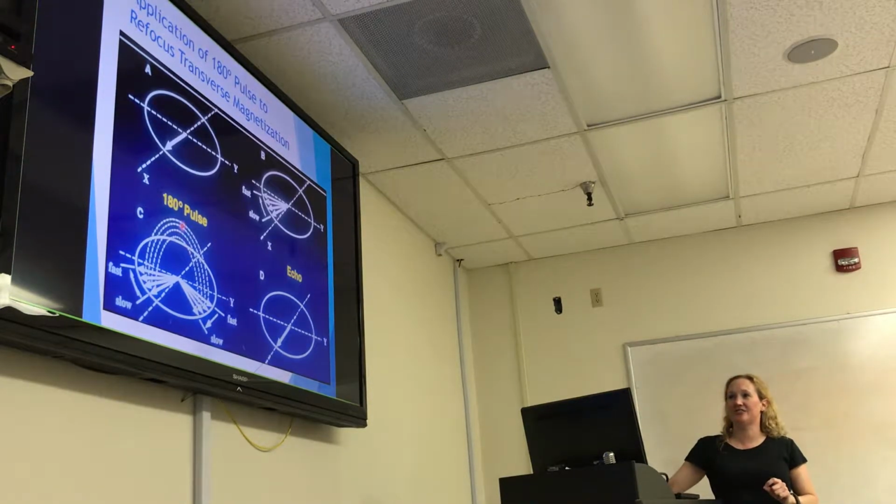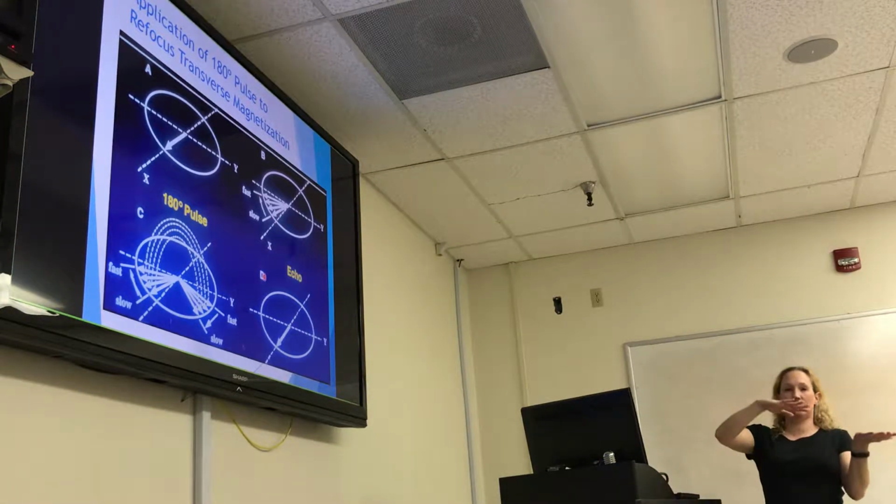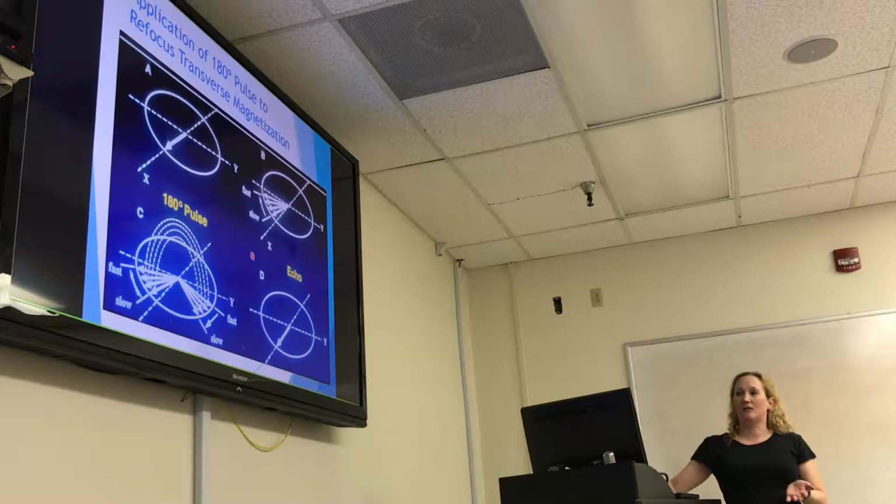Okay, and again, here's just another graphic. So we flipped it to 90 there, and here you can sort of see, here's your fast ones, so here's your leading edge here. The fast ones are getting ahead. Your slow ones are your trailing edge, they're getting behind. But when we flip it 180, now our fast ones are going to catch up with our slow ones. And then here's our rephased echo.